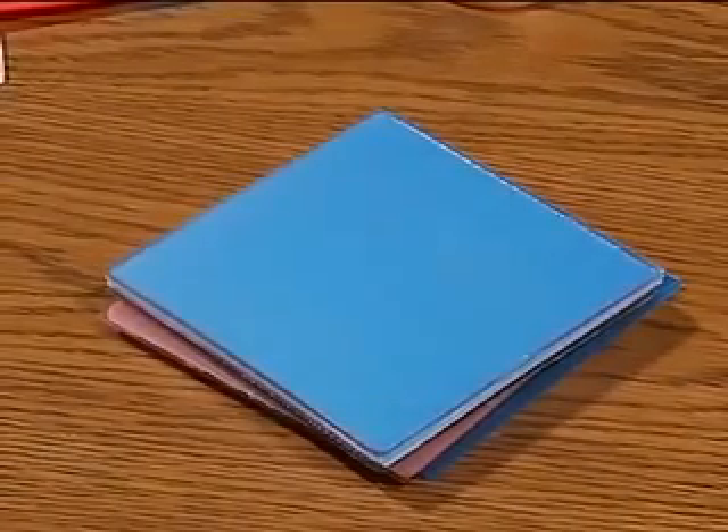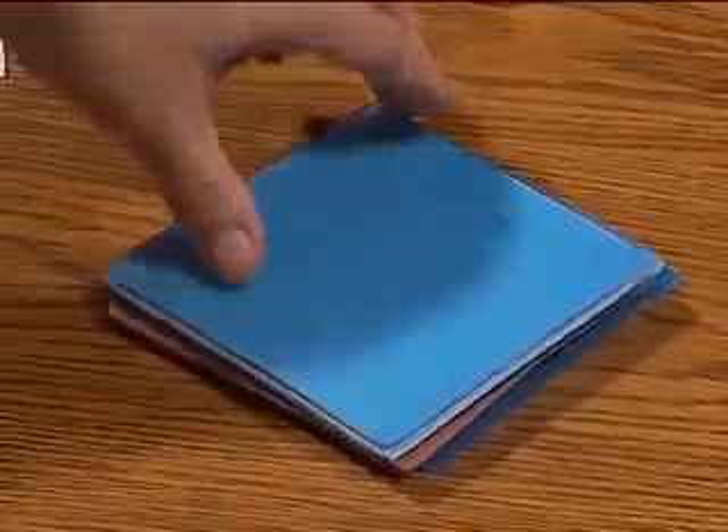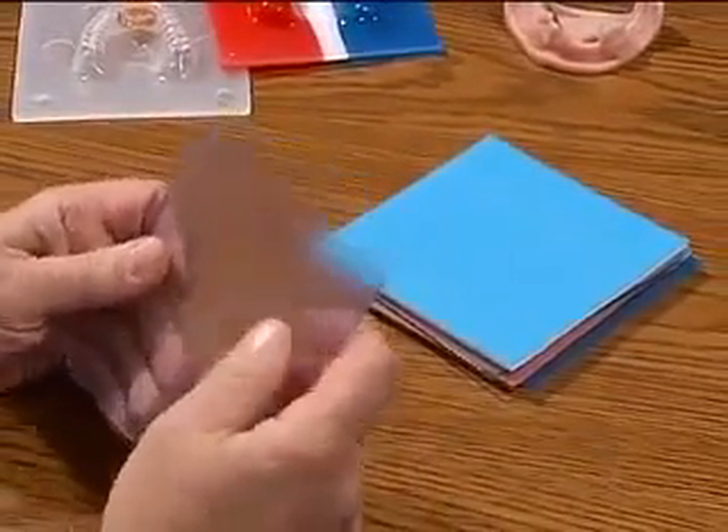Next we have the Dual Laminate material. This is a preferable material for TMD — Temporomandibular Dysfunctional — appliances. The nice feature is that it does have a hard outside area which we can add acrylic to in order to build ramps and so forth.